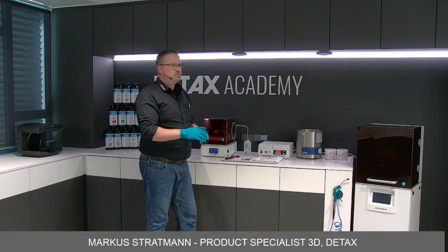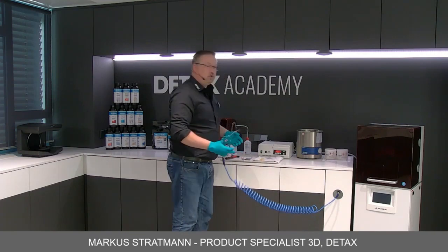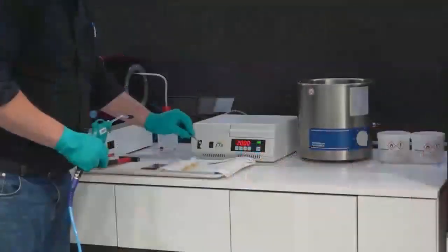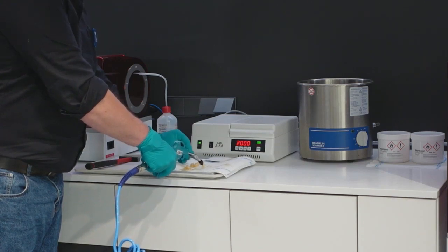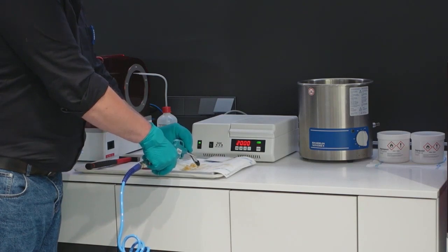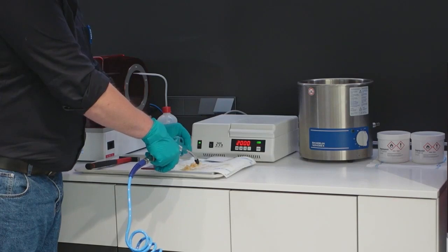A little bit means it is between 0.8 and 1.5 bars. So we use this one here. I love to work clean, so I use a tweezer. I hold here our printed parts, and I blow with a little bit of air the rest of the material away from the crown. In this process step, we will leave the supports on the crowns, because it is much easier later, after the first curing step, to loosen the supports.